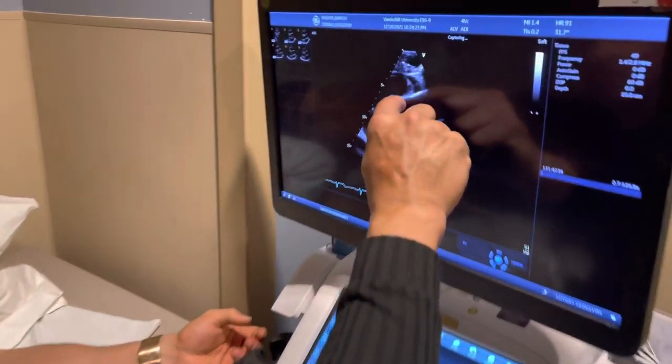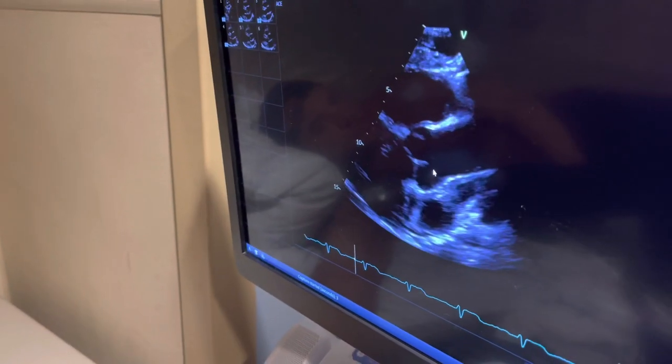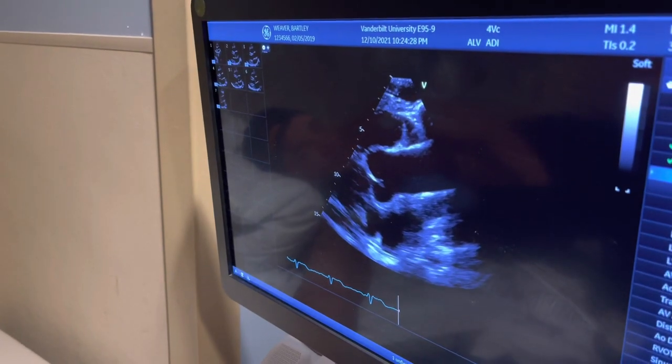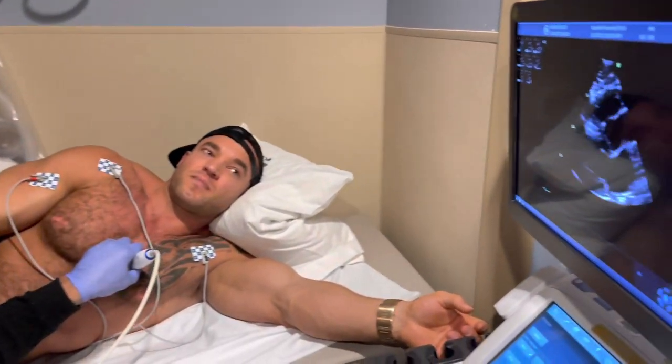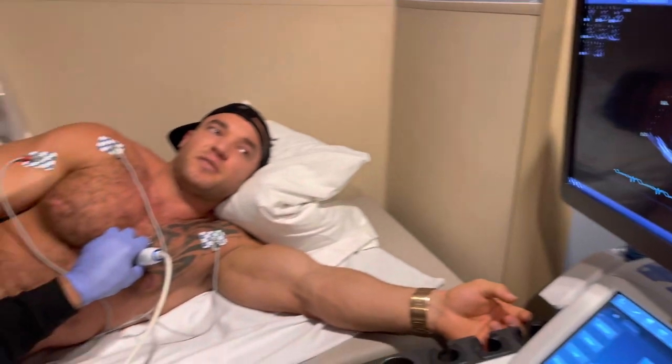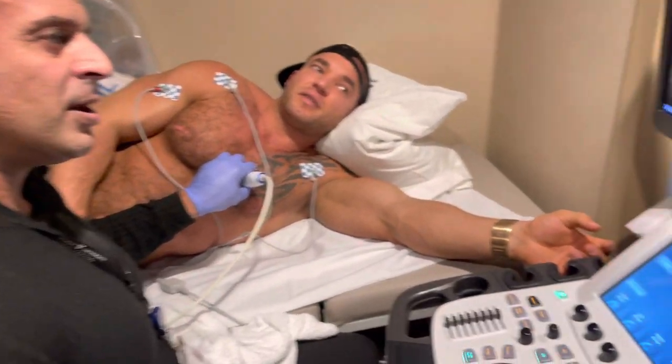This is the ascending aorta — that's the blood vessel that takes the blood up to the brain and to the rest of the body. We're going to measure that too. Everything looks in good range, really good, normal range. Tell me if something doesn't look right. Everything looks perfect.